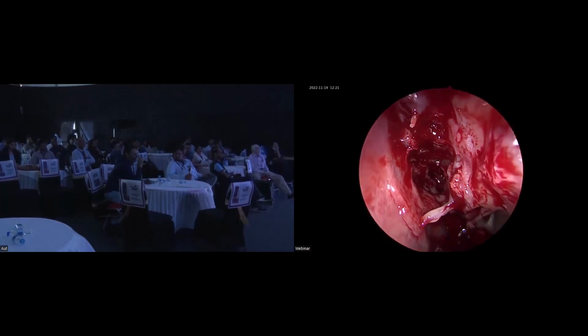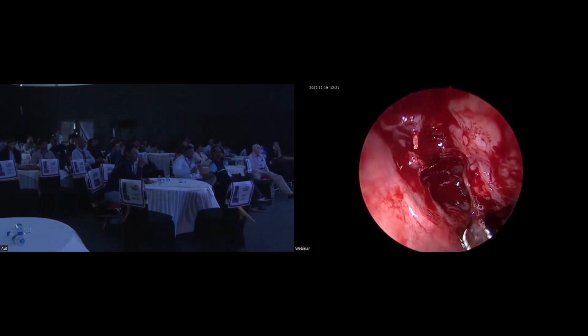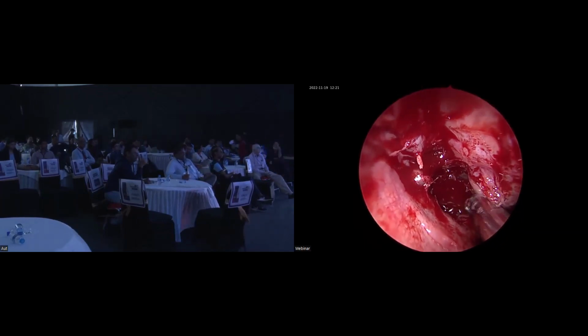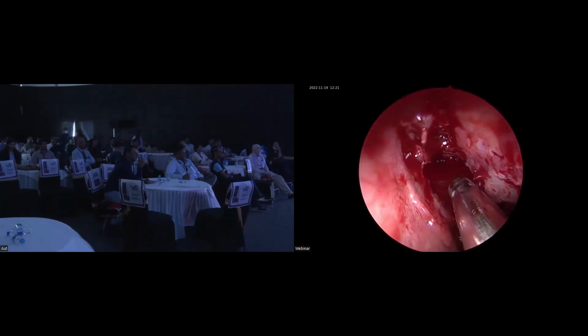Madam, what are the landmarks you are following at this moment? Right now, I've followed the disease, and I have cleared the anterior ethmoid and gone right till the lateral limit.